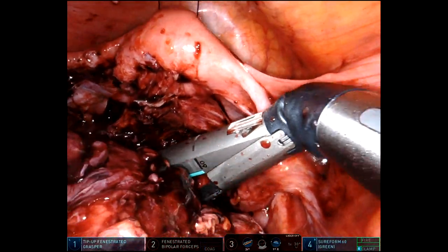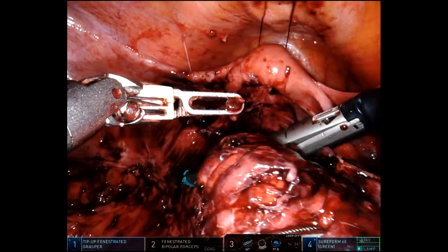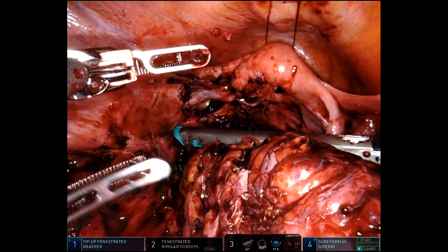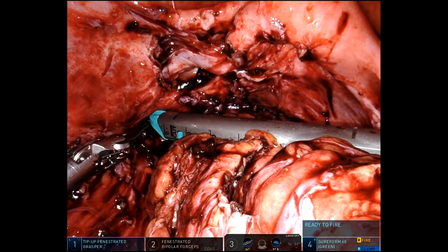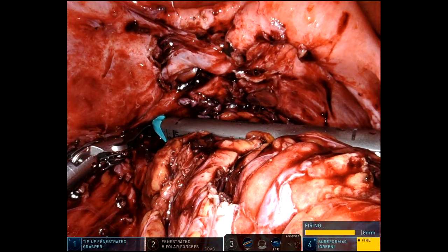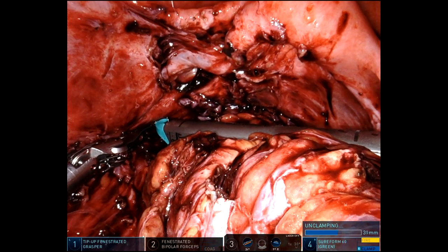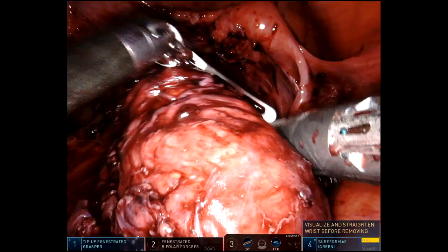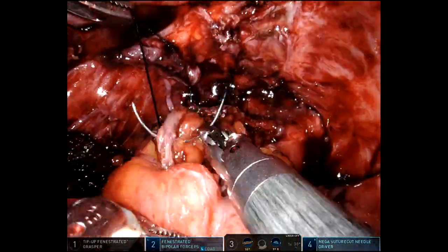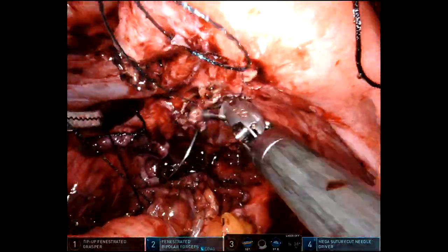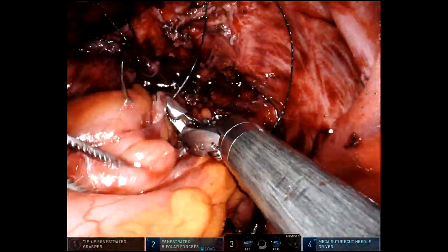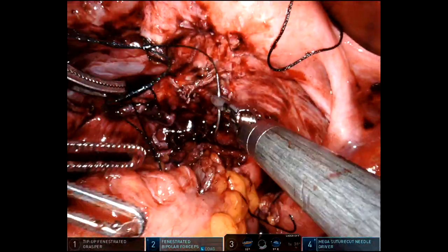I'll divide distally. I had chosen to do an intracorporeal anastomosis here. I did not want to do a transrectal extraction because I was very concerned about that distal rectum getting torn, and I knew it was going to be very challenging to chop up that specimen into smaller pieces. So I decided to just do a hand-sewn anastomosis, which has become my routine.